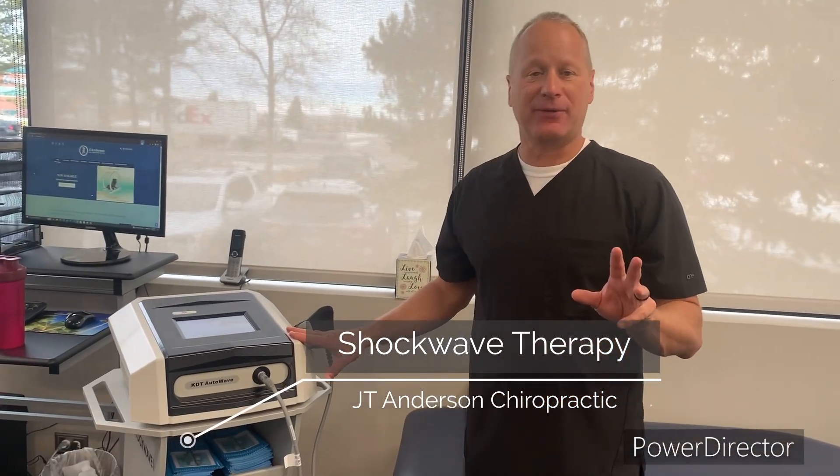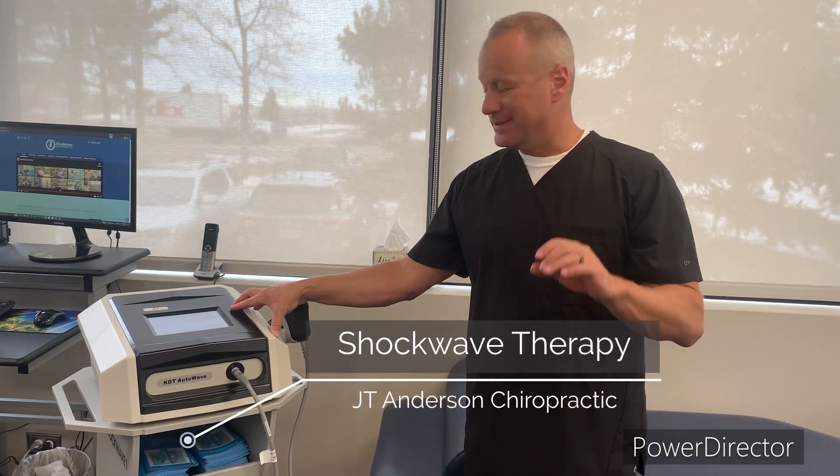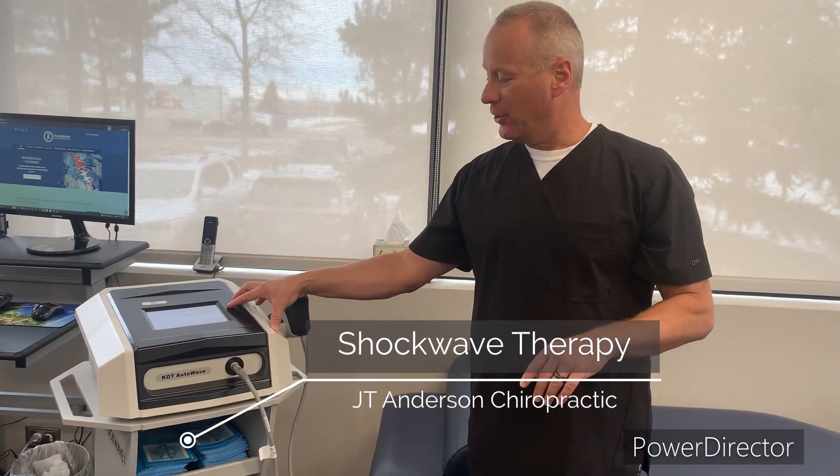The shockwave has three different aspects to it. We have what's called the bars, which is basically the intensity. We have the hertz, and then we have the number of shocks. The shocks are basically acoustic sound waves that can penetrate up to seven centimeters, depending on the bars, the intensity that's being placed into the head.